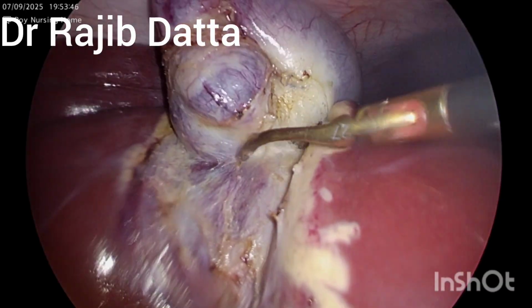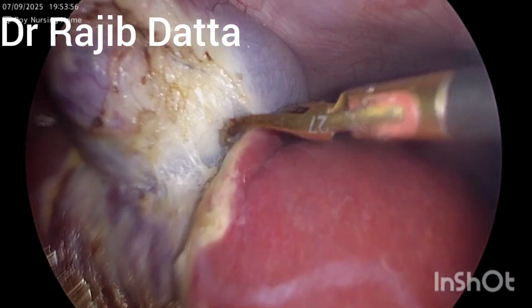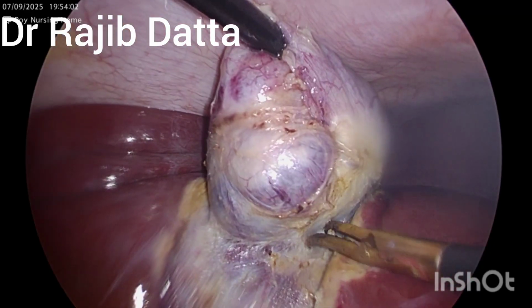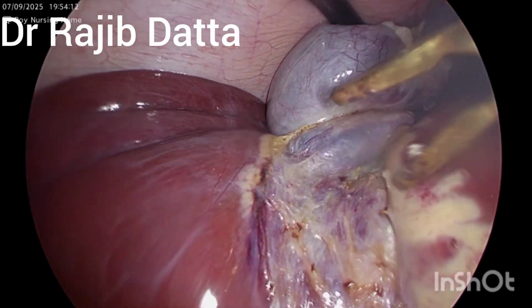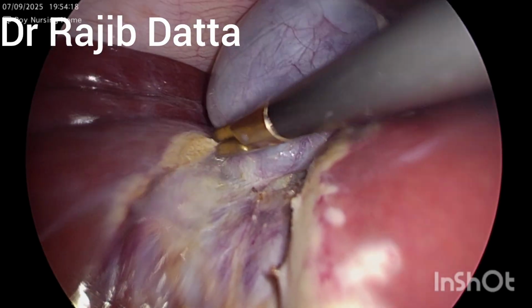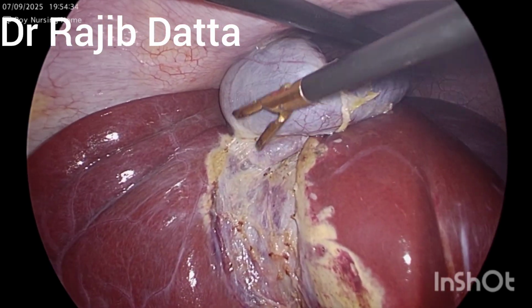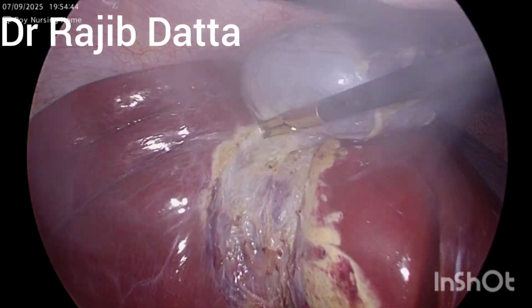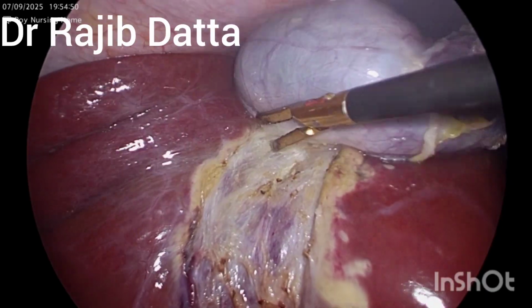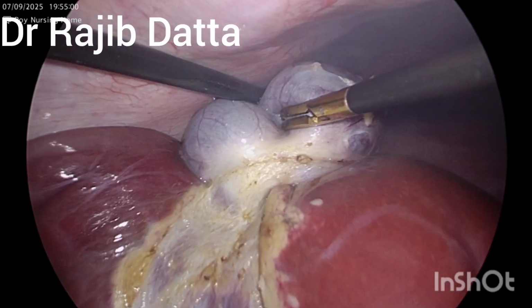And after separating the gallbladder, we will look at the uterus, fallopian tubes and ovaries for any anatomical abnormality or any pathological changes. So again the camera person is changing the view, and I am separating this gallbladder from the liver bed. These fine streaks of tissue are fibrofatty things. It's a grade 1 hepatic steatosis.